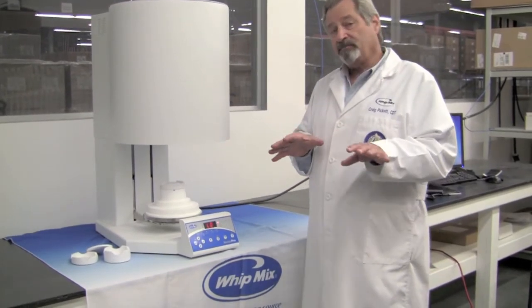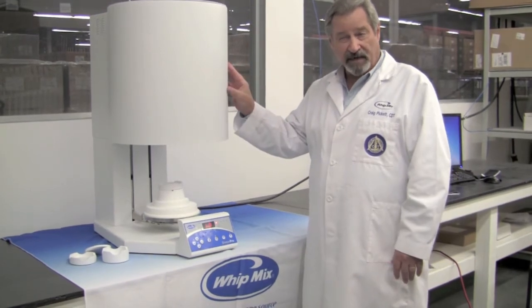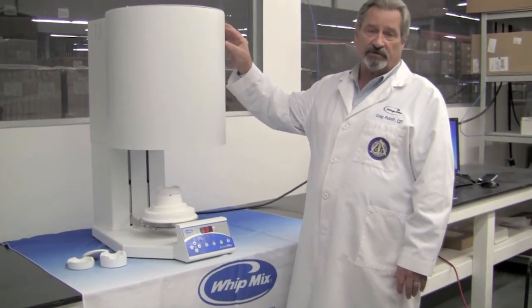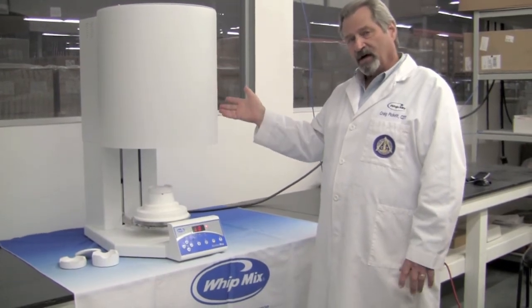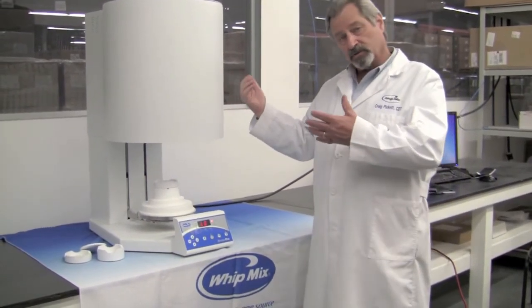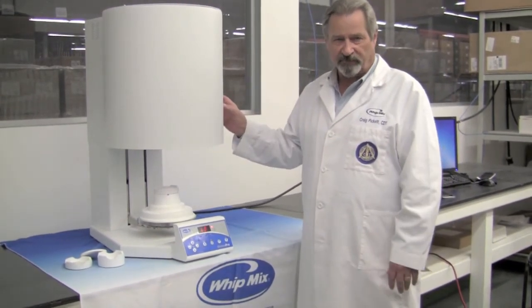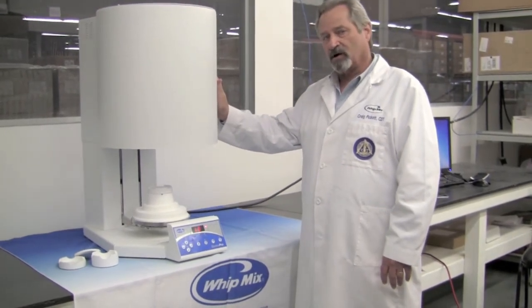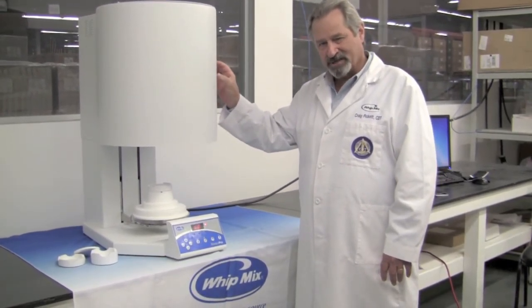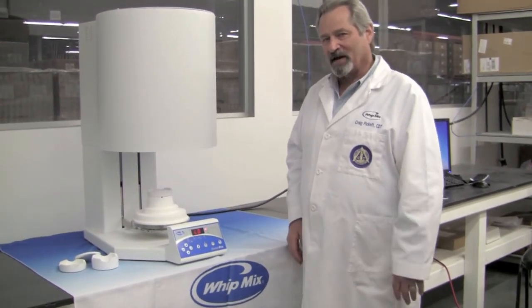At its maximum speed, it will take about 50 minutes to reach the top temperature of this machine. Your cooling is going to be up to you, so that will allow you to determine how fast a cycle you can run on this particular furnace. We feel here at Wittmix that this will meet the needs of many of our friends, and we hope that you'll take a look at this particular zirconia furnace when you're thinking about sintering.